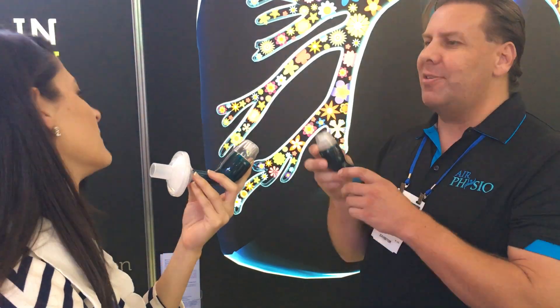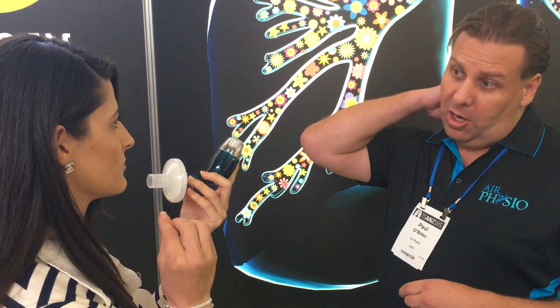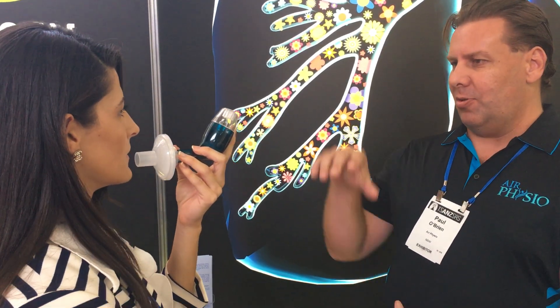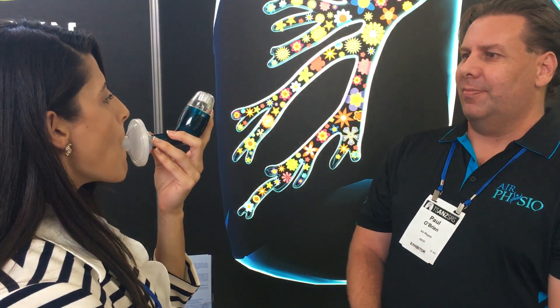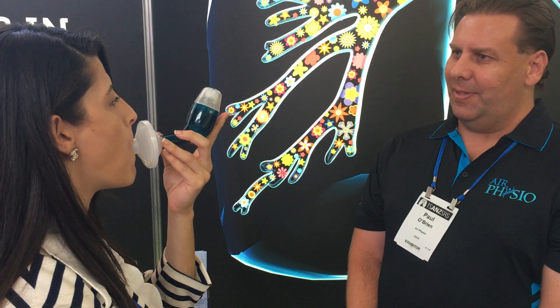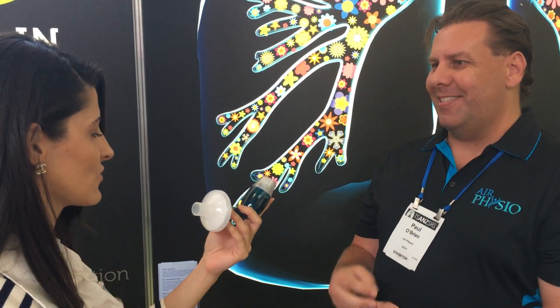Do you hear that sound? That's the vibration. So you just breathe in, hold your breath for 2 to 3 seconds, then blow it out — just tilt it slightly up higher. And you feel that sensation in your chest? The vibration goes right through.